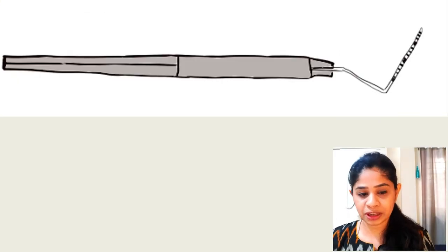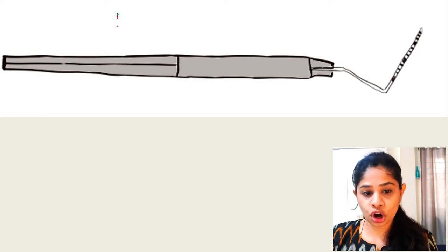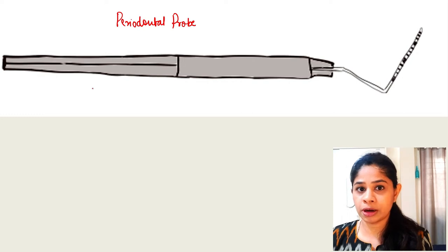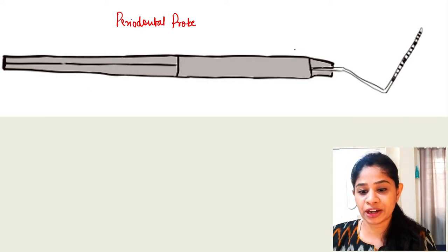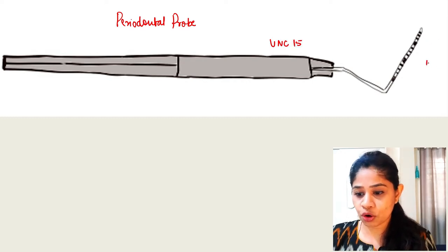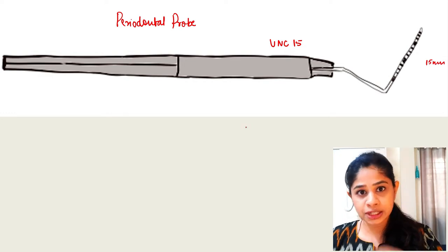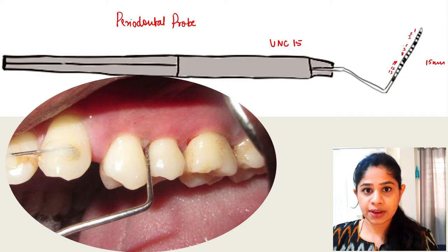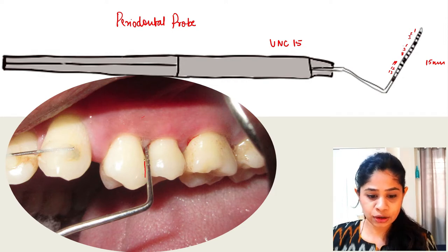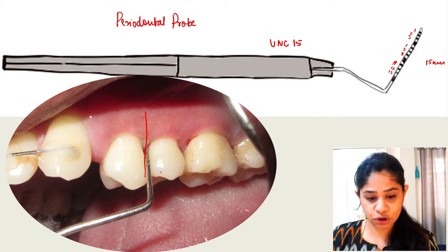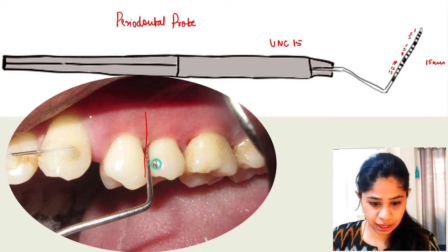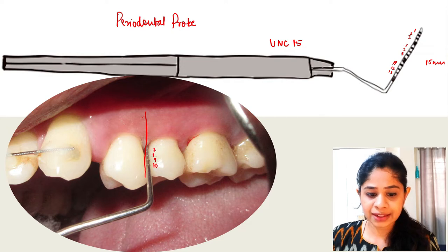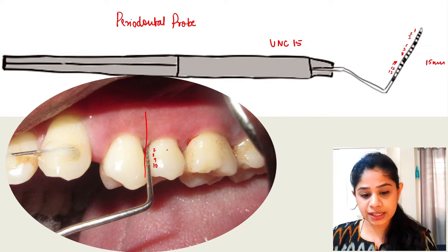First let's talk about probing depth. We are going to use something called a periodontal probe. This is an example of a manual periodontal probe which is UNC-15, one of my favorites because it has a working end of 15 mm, so you can always measure deep periodontal pockets. Here we have inserted the probe along the distal line angle of the first premolar. This is a Williams periodontal probe with markings up to 10. Based on the visible markings at 7, 8, 9, and 10, we can say this particular site has a probing depth of 6.5 mm.